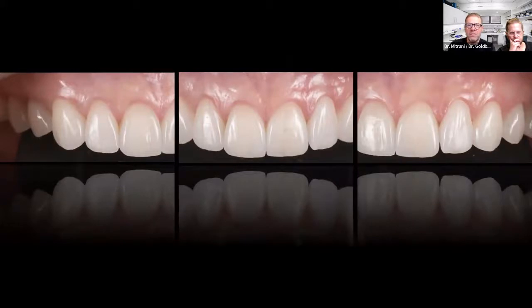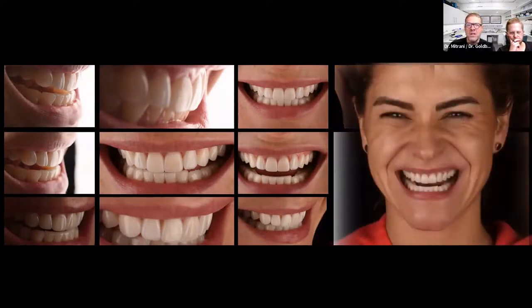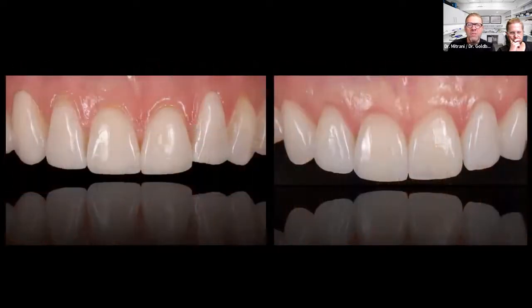So here are the veneers in place and composite images of different aspects of how these veneers integrate in our patient's full-blown smile. So a really, really happy patient. And of course, as usual, we want to see where we were coming from, what was the initial presentation, and how now we're able to provide the patient with the right amount of soft tissue, with the right ceramic restorations, again, removing the previous one with the least invasive approach.